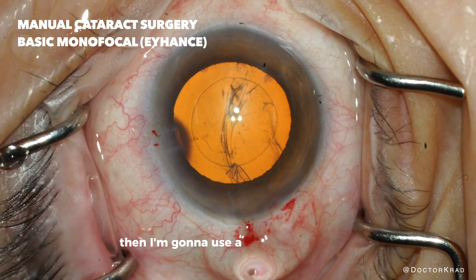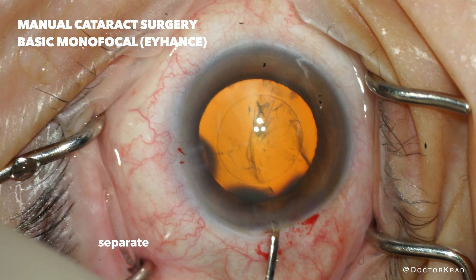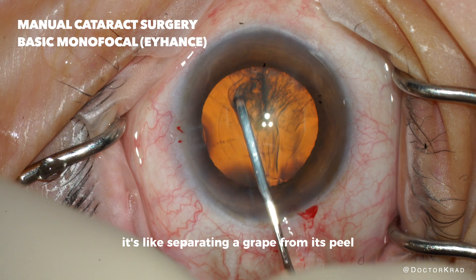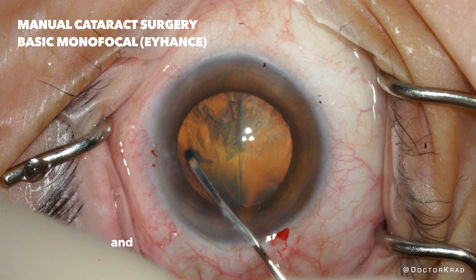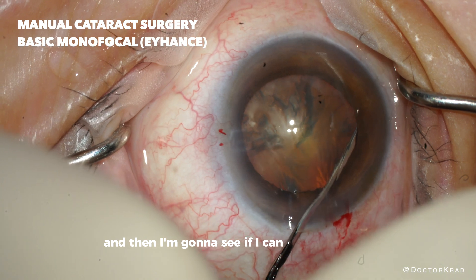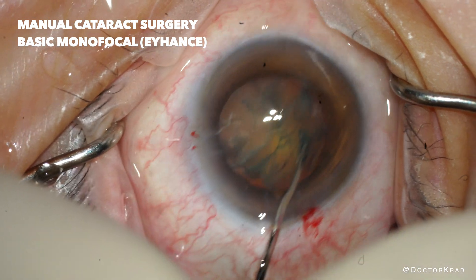Then I'm going to use a cannula with some balanced salt solution and separate the cataract material from the capsule — it's like separating a grape from its peel. There are a lot of cannulas available but I'm testing out a new one for the first time, so I'm being a little careful. I'm going to see if I can rotate and spin the lens, and here we have a spin.